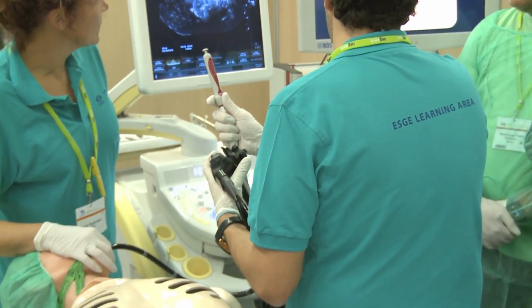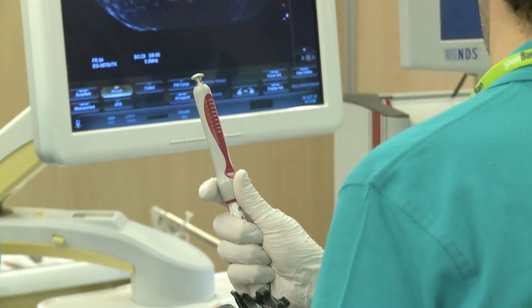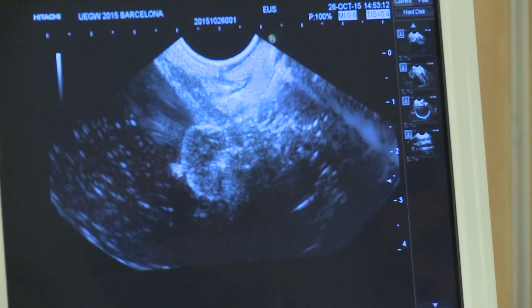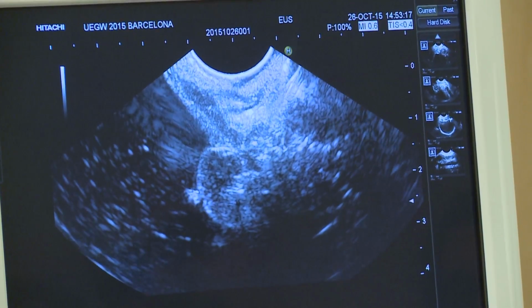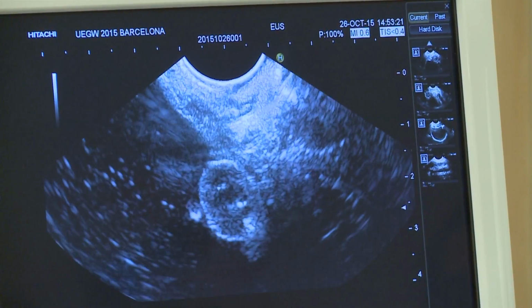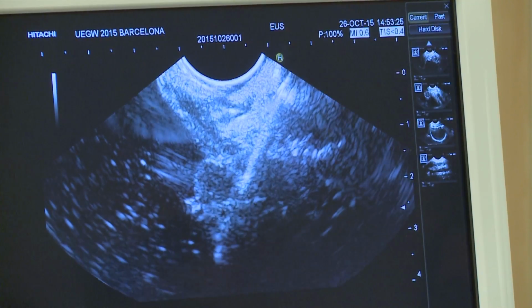So then I start, and you see the sheath, and now you're going to see the needle. You see the needle? Yeah. Okay, so now I'm trying to go directly. Okay? You can change until I go inside. Okay? Here, where is the tip?